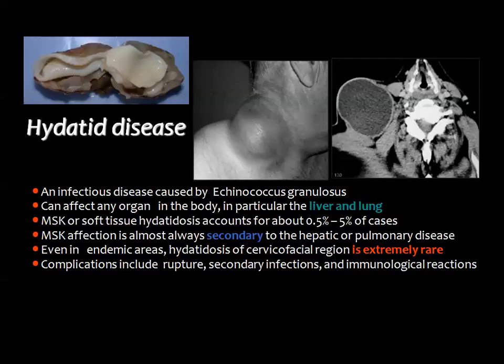Similar to any hydatid cyst located anywhere in the body, it is a well-defined lesion of appreciable wall thickness with clear water content. Sometimes you can see calcium in the wall. Sometimes you can see floating shadows within the cyst itself representing the endocyst, and sometimes you can see small daughter cysts arranged along the inner aspect of the wall of the hydatid cyst.